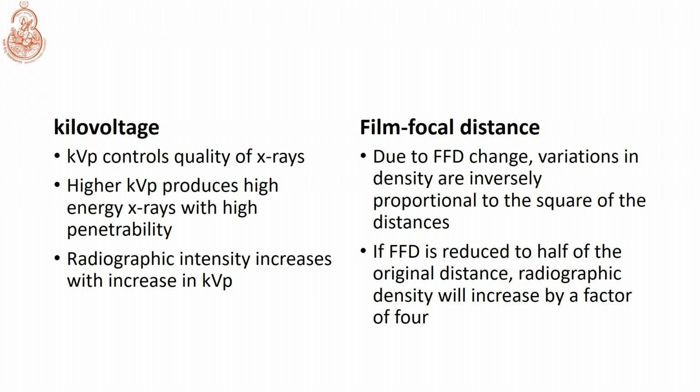If I make the distance more, I'm going to have a fourfold change in the X-rays hitting the people surrounding.